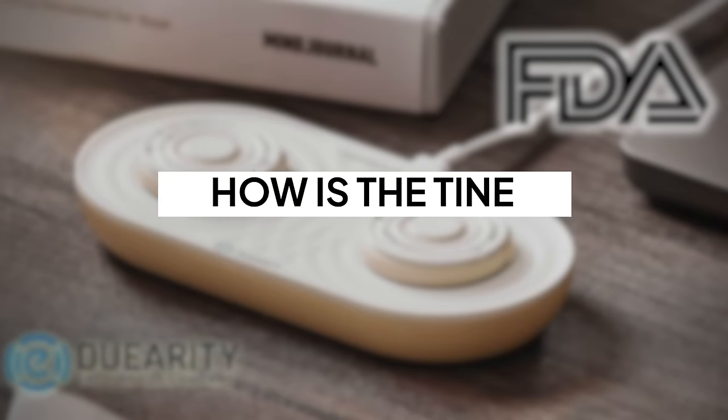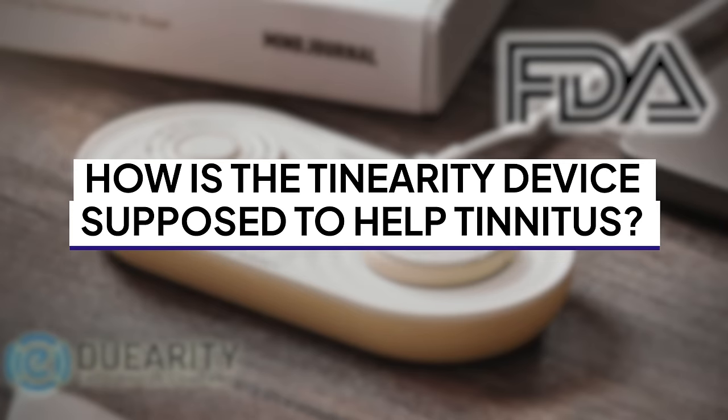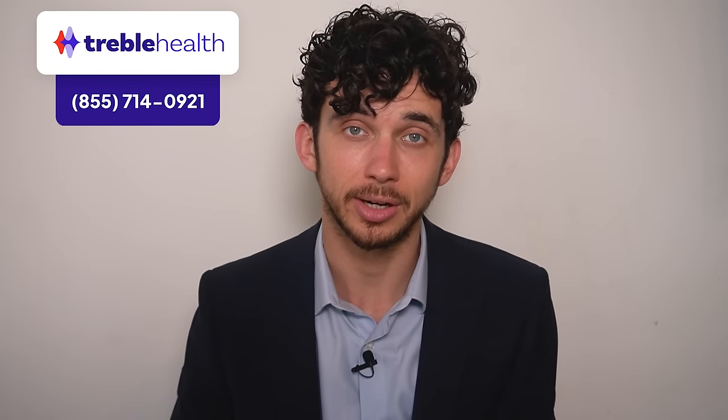The real question is how is the Tinearity device supposed to help tinnitus? It uses sound therapy treatment, which is the idea that you can treat your tinnitus with a consistent low-level sound set just under the volume of your tinnitus. Used during the treatment period, after that period is over, your tinnitus is reduced, the baseline level is improved, and you don't need the sound therapy anymore. In my experience, sound therapy works — there's a lot of evidence supporting it, and it's something I use all the time for my patients who work with Treble Health, the company that I started.